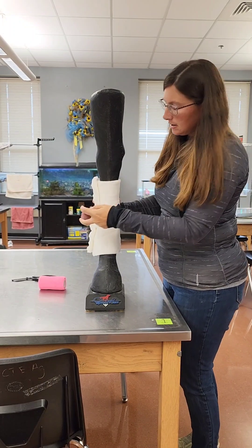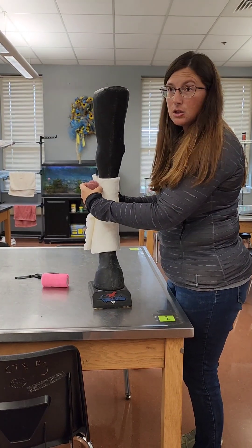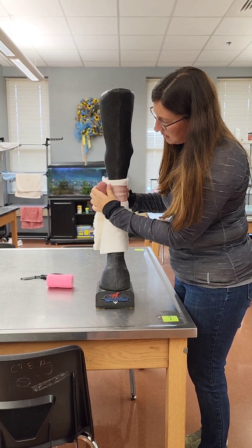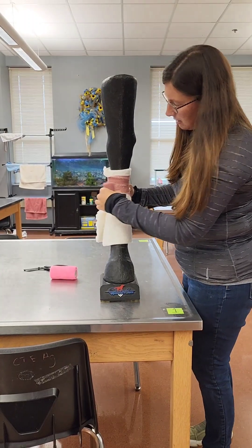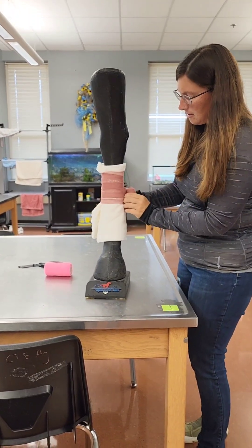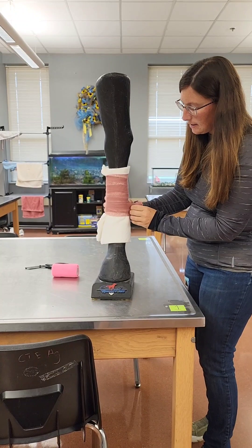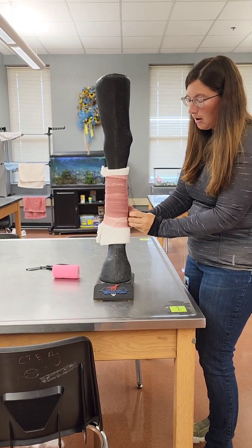Then you take your brown gauze and start at the top of your bandage, about an inch from the top of the cotton. You will wrap across the bone, front to back, again in equal, wrinkle-free pressure layers. You don't need to be pulling it tight — it needs to be snug so it doesn't slide, but it does not need to be tight and restrictive to the blood flow.